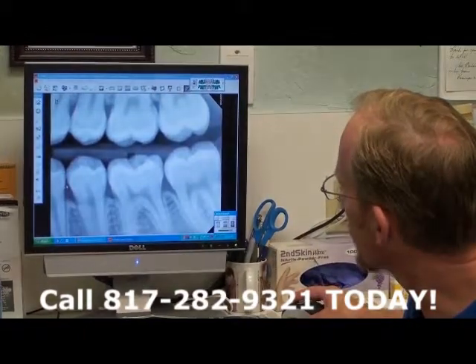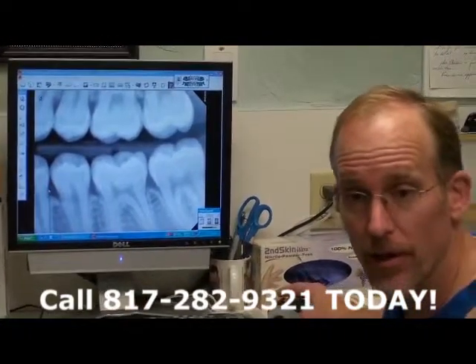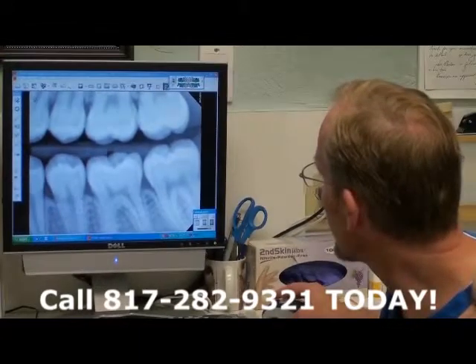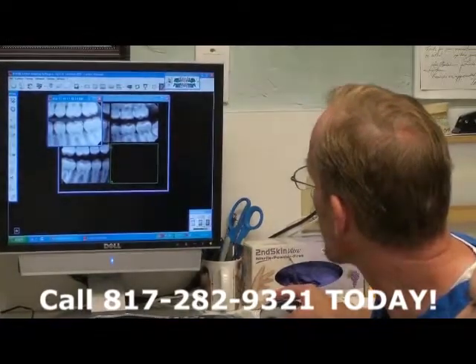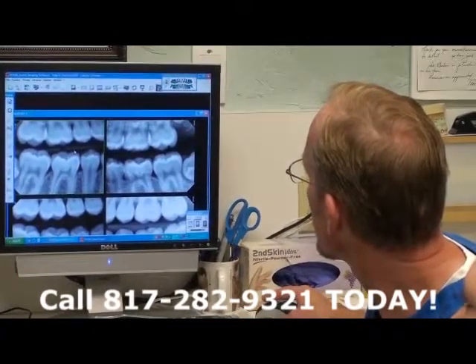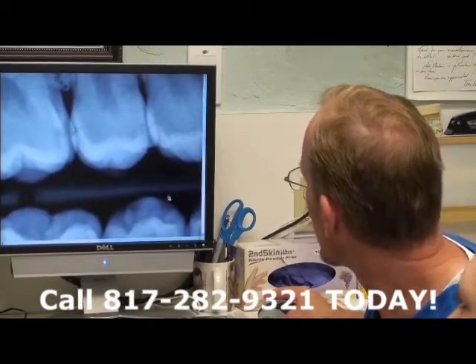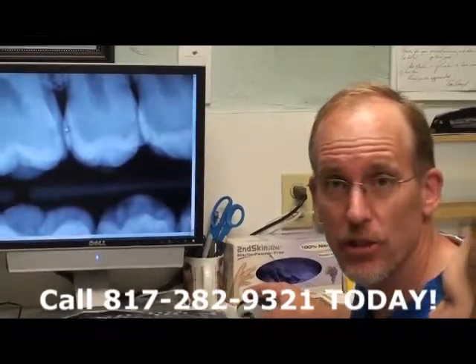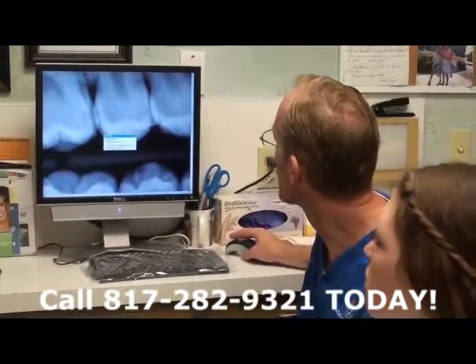I can see when it's lighter, sometimes I can see areas on the teeth where there's tartar buildup, or areas where you can tell that they haven't flossed and they have buildup. And then we look for small areas where they potentially have cavities. For example, on this x-ray here, I can see a little shadowing in between the teeth, and that is what they call an incipient lesion, or it could be a cavity depending on how far it goes into the tooth.